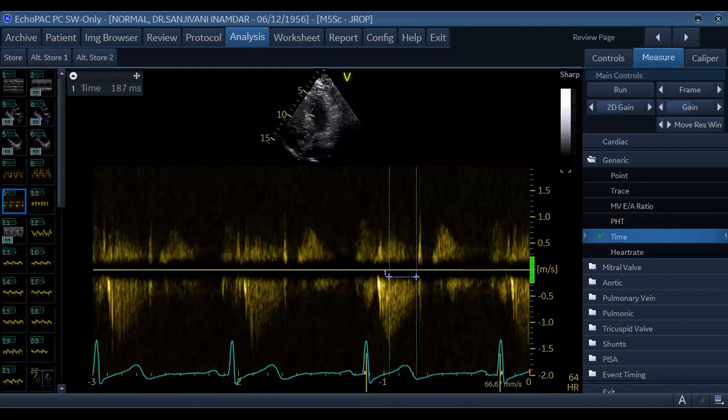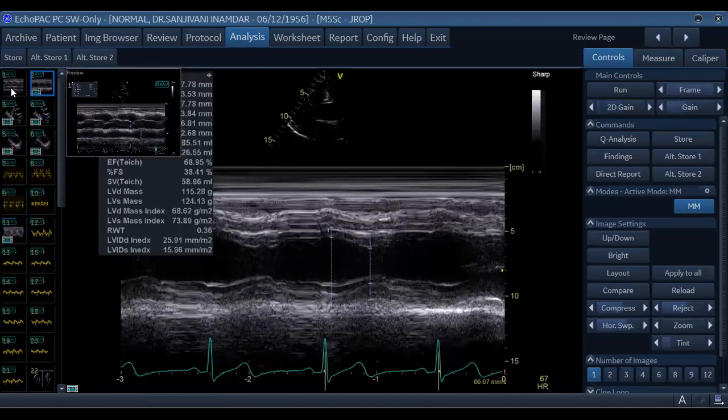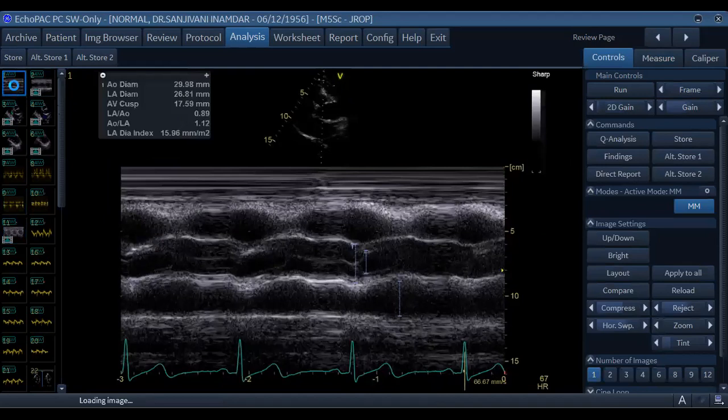Regurgitation, okay. I didn't understand, sir. Regurgitation is a different thing. What is in your mind to look for a slope? We look at the EF slope when we are looking for mitral stenosis. That is different. That is a very simple thing, if she's looking for EF slope or mitral stenosis, that is what exactly she knows.